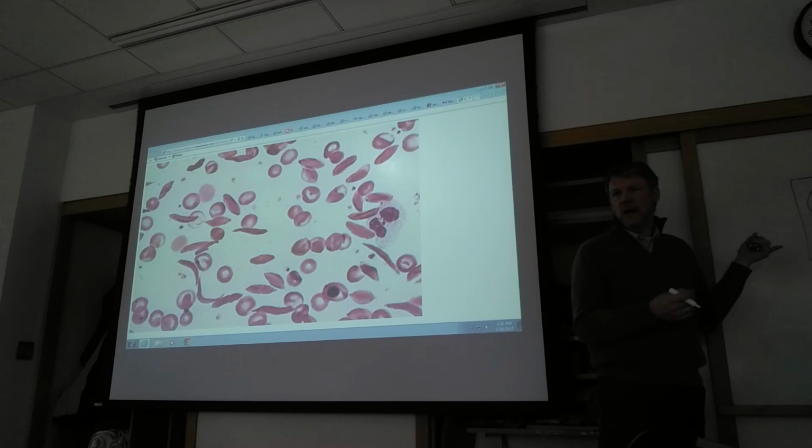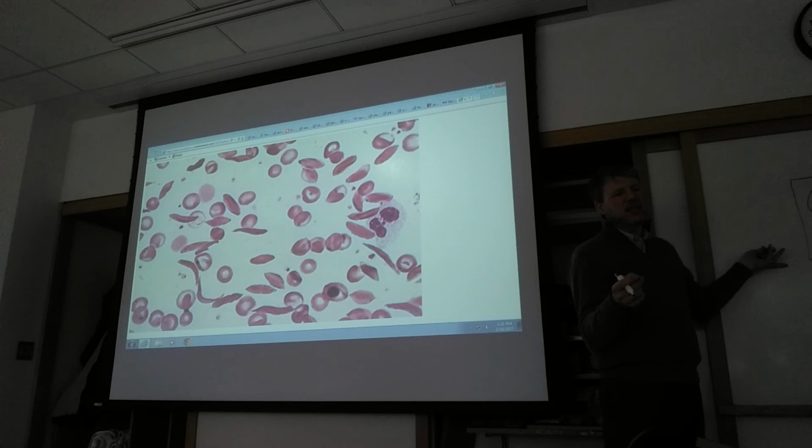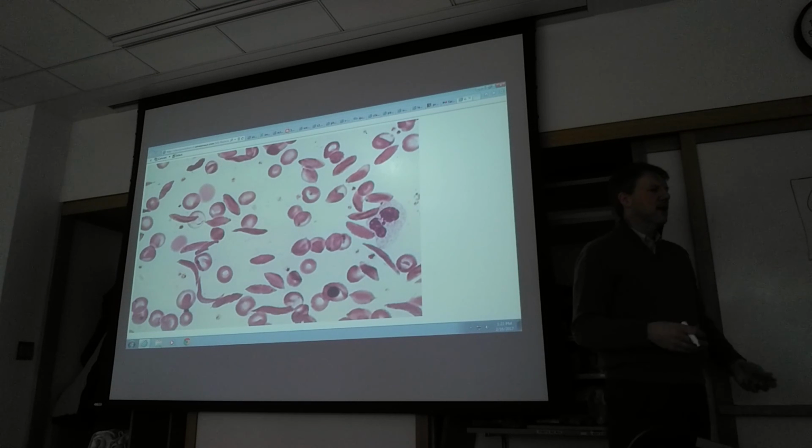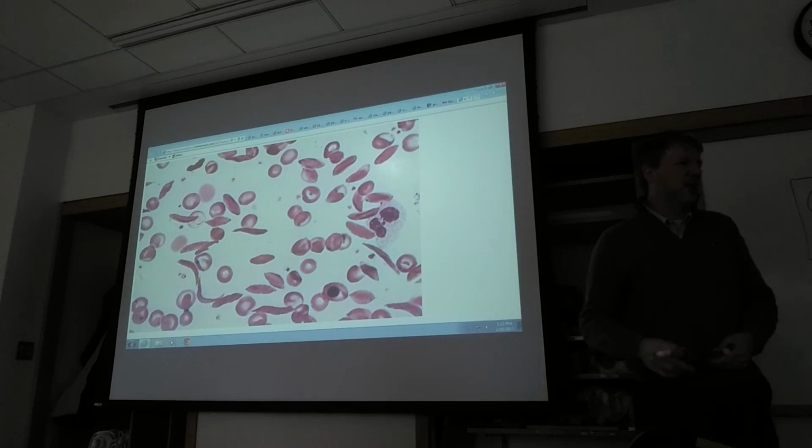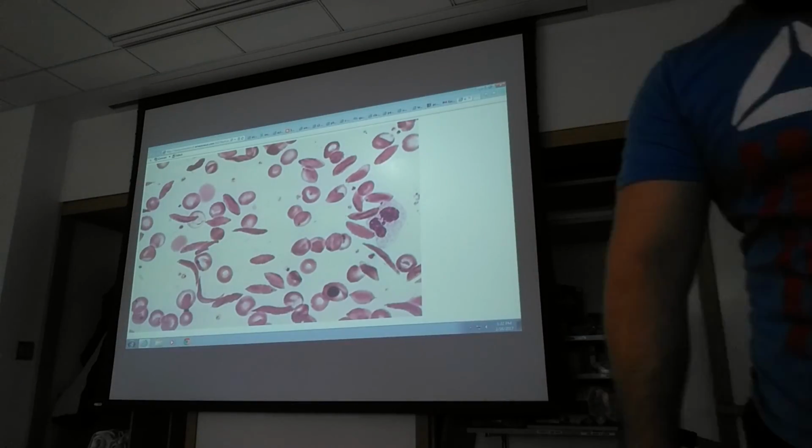Anyway, any questions about what's going on with that? I'll come around and help you. Hopefully it'll work nice like that. I've got to be honest, sometimes I think these fake chemicals get old and it doesn't work quite as well. But they have expiration dates. Try that out. Grab some microscopes, look at some of the, I'll get the blood slides out, look at those.